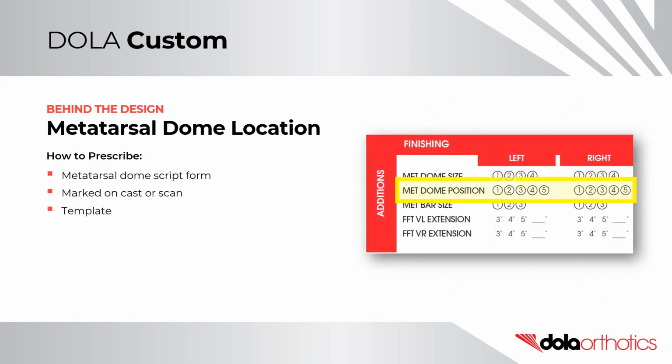How to prescribe your metatarsal dome location. You can use the metatarsal dome script form by marking a single number for an apex or 2 numbers for an interdigital space, i.e. 2-3. You can also mark it on your cast or scan or use a template.